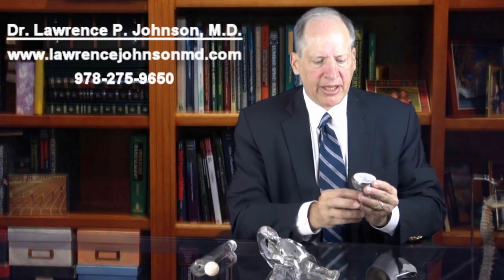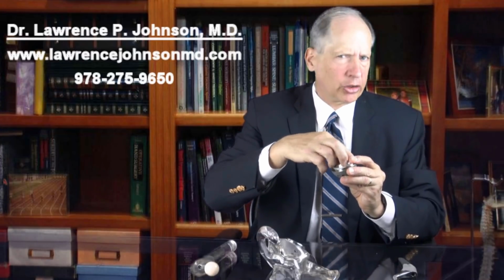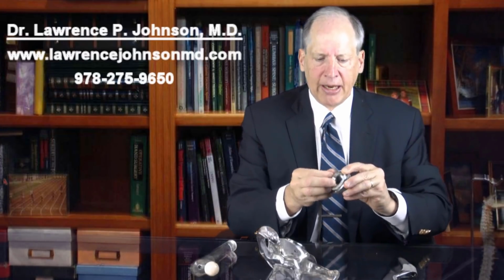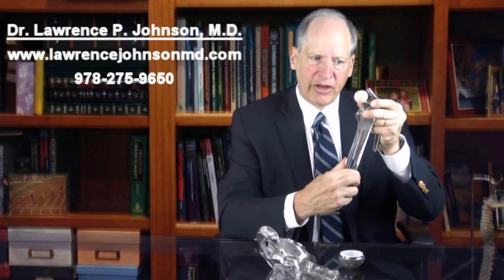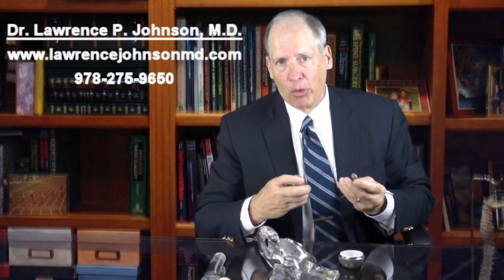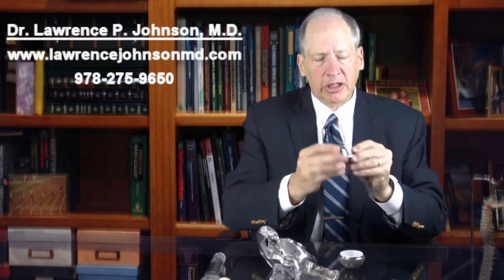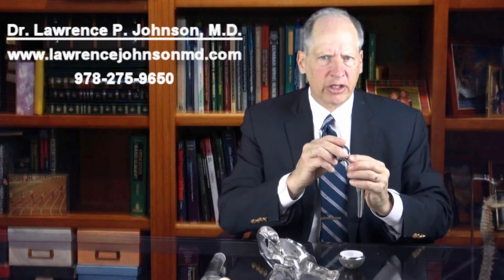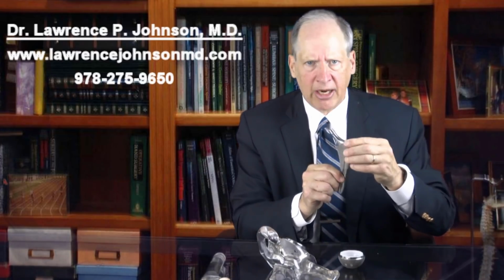Into that goes a femoral head, which is nice and round, perfectly round like your hip should be, but usually isn't by the time you need the hip operation, and that rotates in here. This is affixed, that is secured to the femoral component, which goes into the thigh bone, the femur. We have a lot of different sizes of people, so we use a different size of prosthesis, the right one for you. So we put this on and we find out making sure that it fits just right. If it doesn't, we may change the head size up or down a millimeter or two, or the size of the prosthesis up or down a millimeter or two.